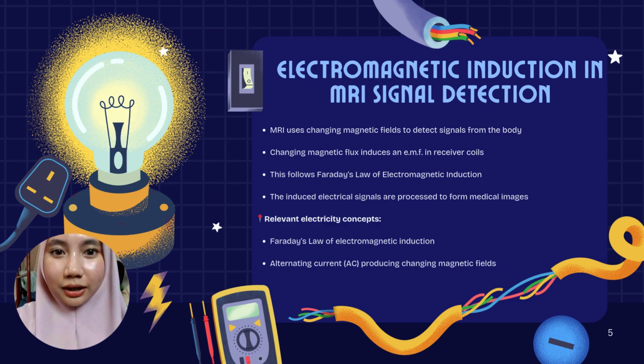Next, I will explain how electromagnetic induction is involved in the MRI machine. In MRI, changing magnetic fields are used during the imaging process. When the magnetic field changes, it induces an electromotive force, or EMF, in the receiver coil. This follows Faraday's law of electromagnetic induction, which states that changing magnetic flux induces an electric current.